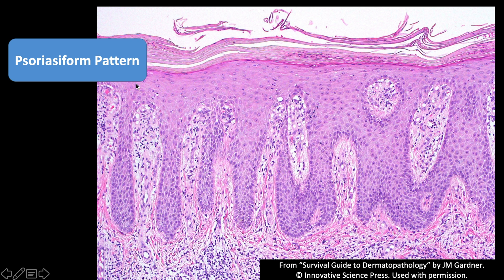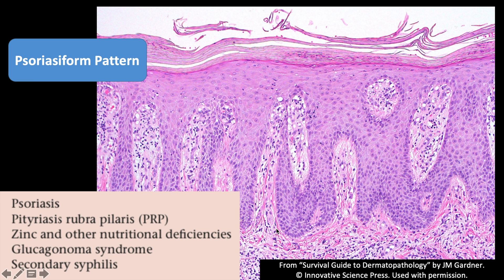Psoriasis also has dilated little tangles of capillary blood vessels in the papillary dermis — I find that one of the most useful findings. Even early or unusual examples of psoriasis usually have that. The only problem is if you have a biopsy from the leg, stasis vascular changes can look similar, so it can be harder to tell. There's usually a mild lymphocytic infiltrate, but not a ton of inflammation in most cases.